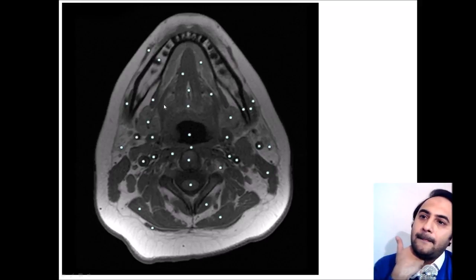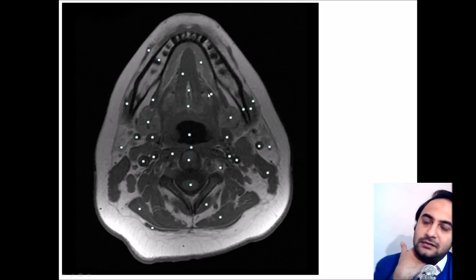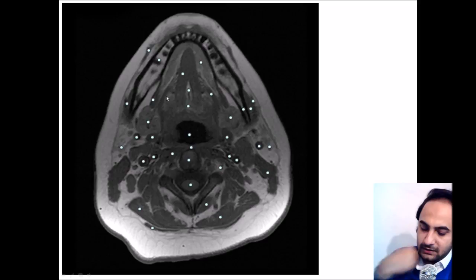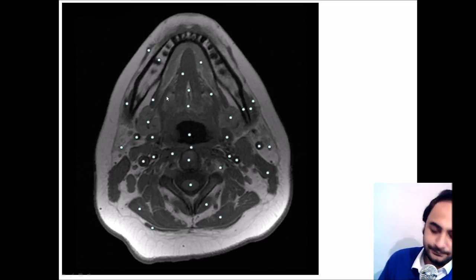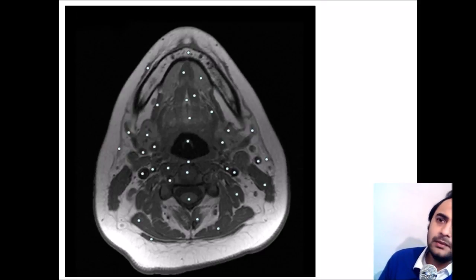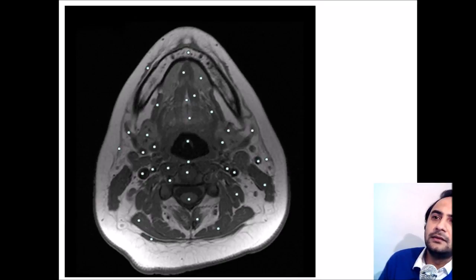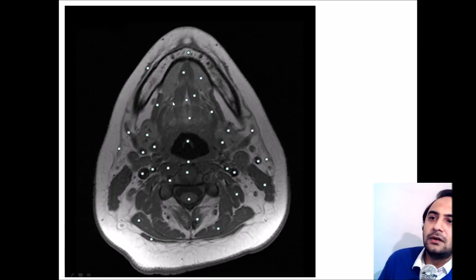This curved muscle which you see bilaterally is the hyoglossus. It is more appreciable on the next slide — yes, this curved muscle here is the hyoglossus muscle.